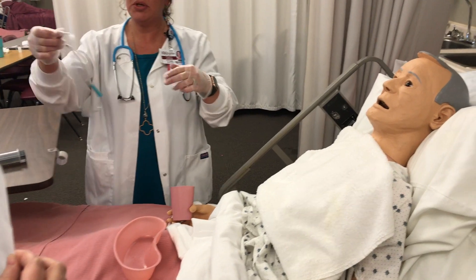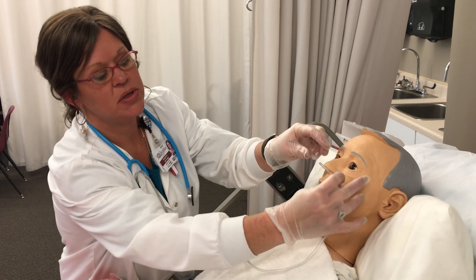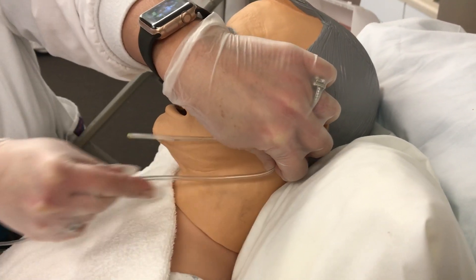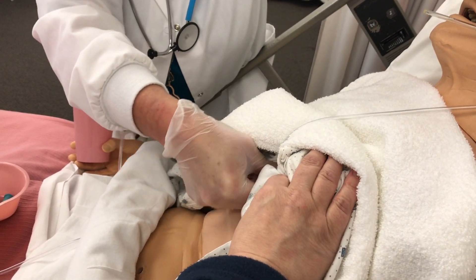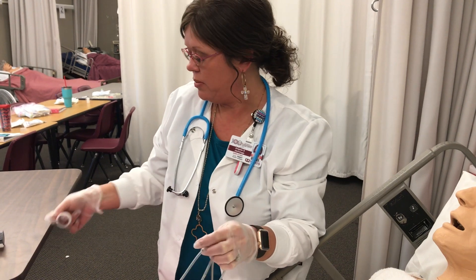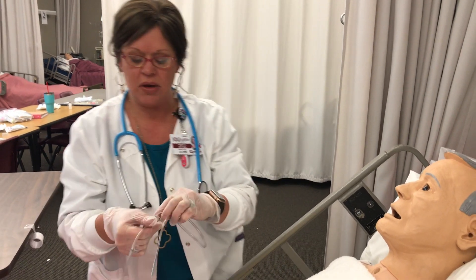Now I'm going to determine the length of how far we need to insert the NG tube. I'll take the tip, starting at the tip of the nose, go to the tip of the ear lobe, hold it there, then go down to where I can feel the xiphoid process. You go to the tip of it and you mark. There are already a lot of markers on these tubes, but you can mark with a Sharpie or a little piece of tape to indicate exactly how far you need to go.